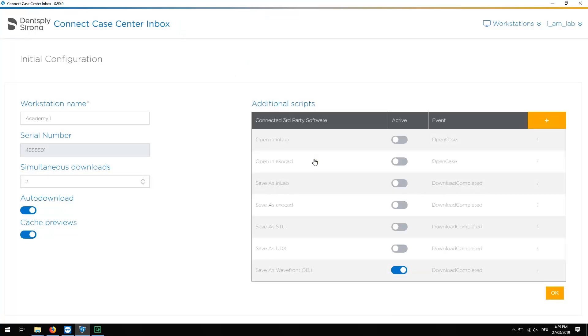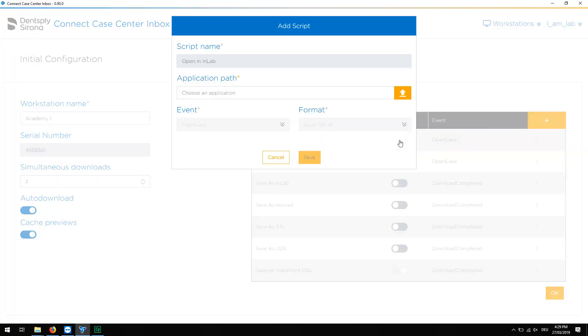We proceed similarly with enabling the script Open In InLab. In this case though, we must look for the application path of the InLab software Installations.exe file.